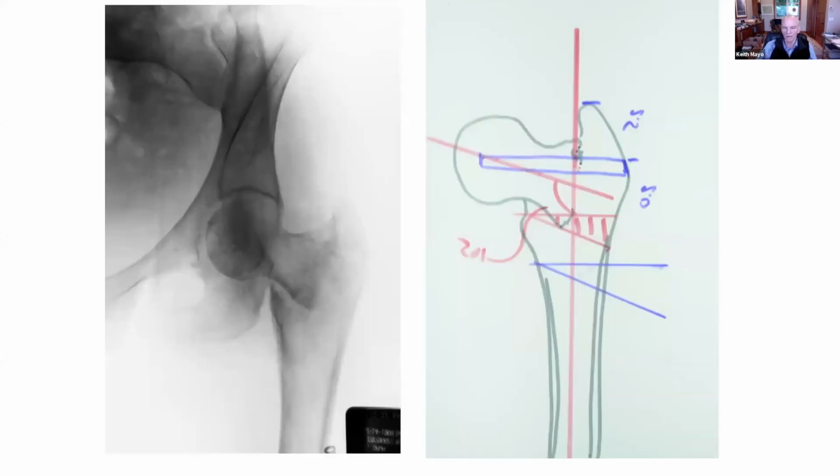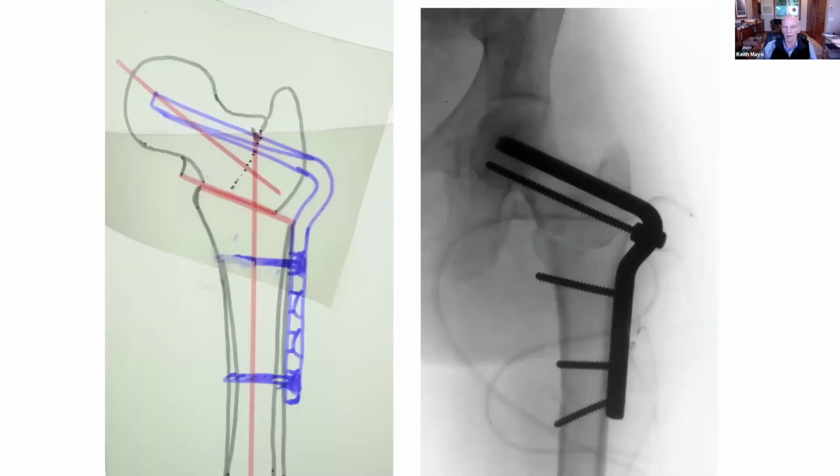We don't know what his leg lengths are because he has a flexion contracture of his right hip, maybe even of his left. And so now we're going to plan to axis. And so what we're going to do, instead of using a normal, we're going to correct back to a CCD angle of X. Usually 130 would be a good place to go. And so that's what the planning would then be, going back to a correction to a roughly average CCD, a normal anatomic axis. You can see how thin his cortices were, so there were some additional issues with this in terms of fixation, but that was the final correction, okay?